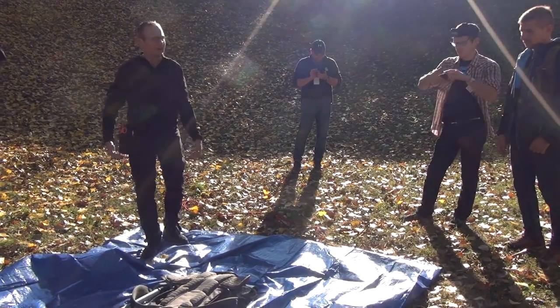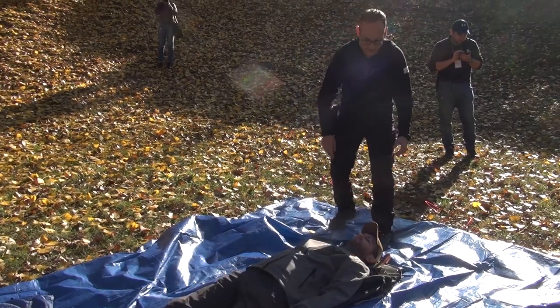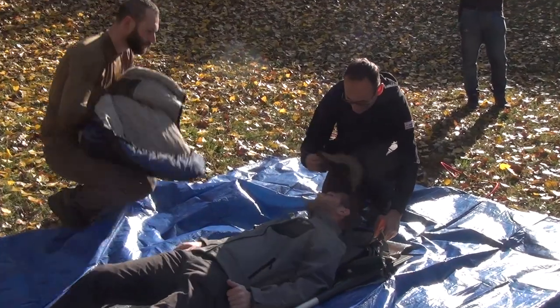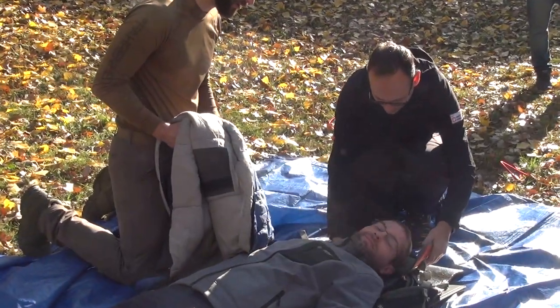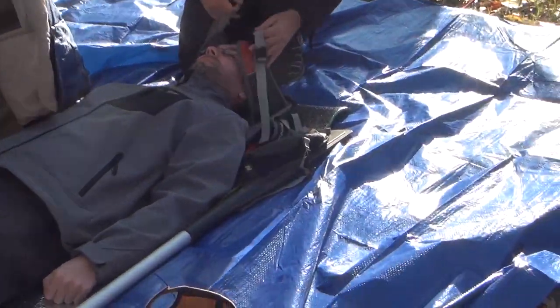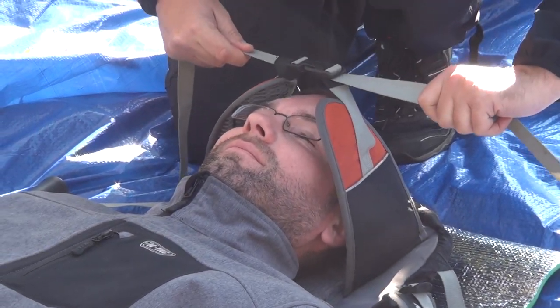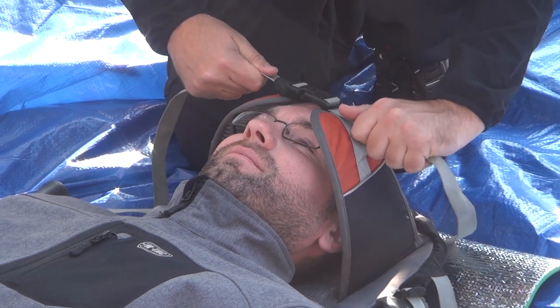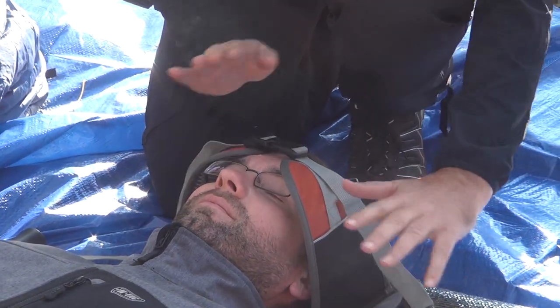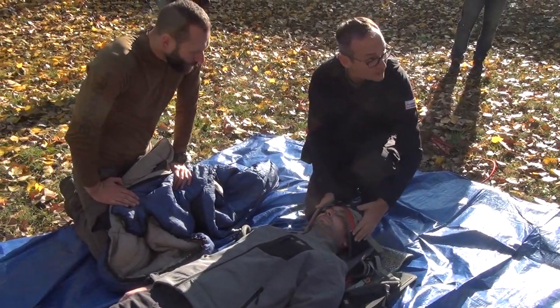Now our patient comes and lays down. Normally we help him, transport him here. So we lay him down like this. And then the sleeping bag, just go a little bit more up. So you can use the sleeping bag, the belt of the bandage, basically for C-spine immobilization. There will be rigid poles here in the back. This will make sure that it doesn't move. You can use the SAM splint to put around if you have it, but this really helps the patient.